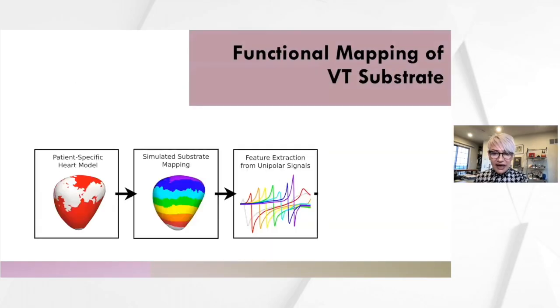Once we conducted that, we used the simulations to recreate electroanatomical maps. From the simulated propagations, we calculated electrograms on the epicardial and endocardial surface.